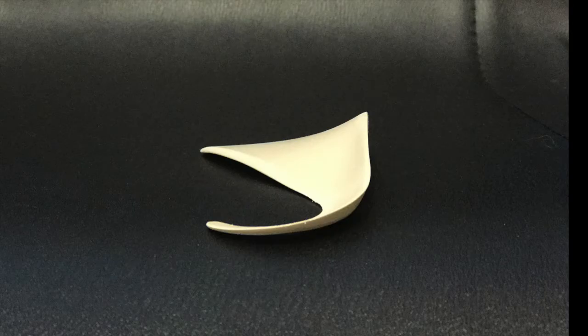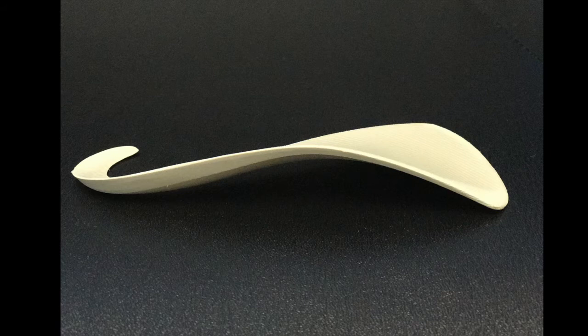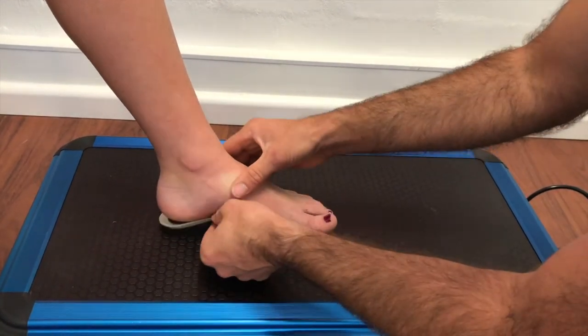The 5th and final style available is the Joey Court Hook. This device is essentially a Joey Support, that is a 4-degree mid. However, in the case of the Court Hook, it has no lateral column. This style of device is often used in women's shoes with insufficient room in the heel to accommodate a full heel cup, for example, a pump or wedge style shoe with a shallow heel seat. For high-heeled shoes, the Court Hook can be heat adjusted to match the profile created by the high heel so that the orthotic sits square in the shoe. Finally, as the Joey Court Hook has the same medial arch profile as a Joey Support, this style is suitable to normal or common foot types.